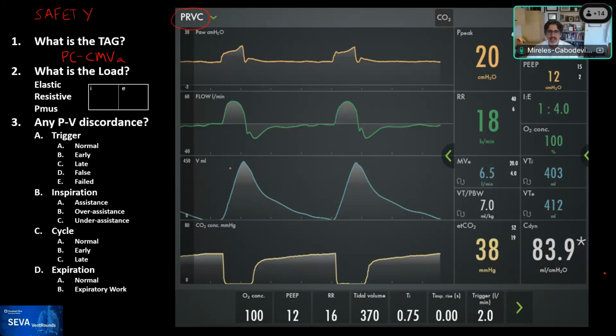These are nuances that are required in a taxonomy to ensure that we're classifying all the modes correctly. There are some modes that took us off guard, and well-set rules can help you do this very clearly when you follow them appropriately. I think what Ariel is putting there is that the same name of the mode in another ventilator has a different tag. And that's something that we recognize actively. There are modes called volume control that have different tags, even though they have the same commercial name. So thank you, Ariel, for highlighting that.